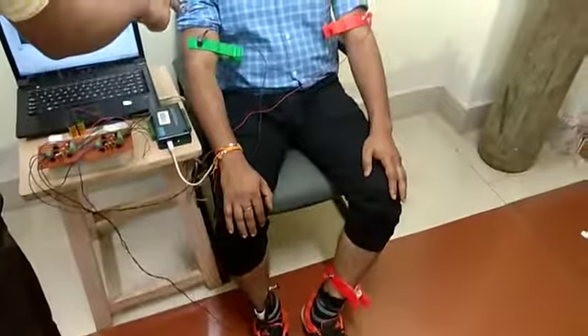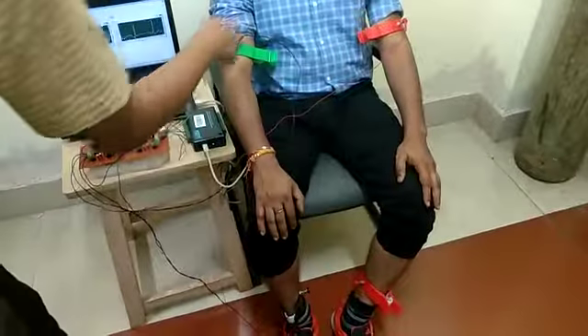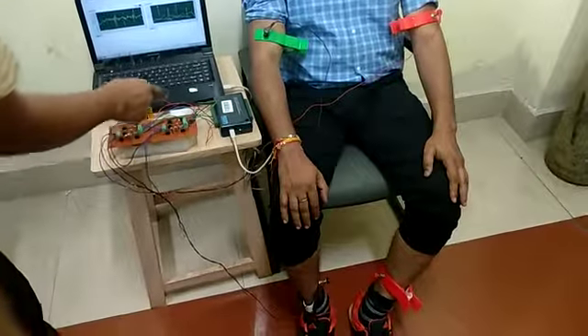Here we can see the lead configurations. We have connected electrodes on the right arm, left arm, and right leg, which corresponds to the Lead 1 configuration, and this is giving data through the first biopotential amplifier.